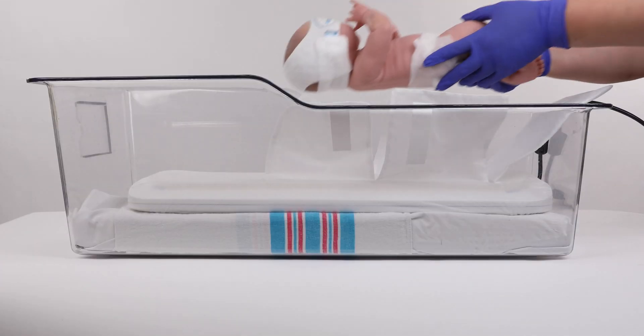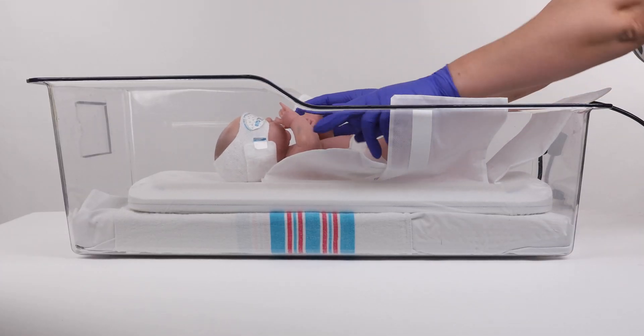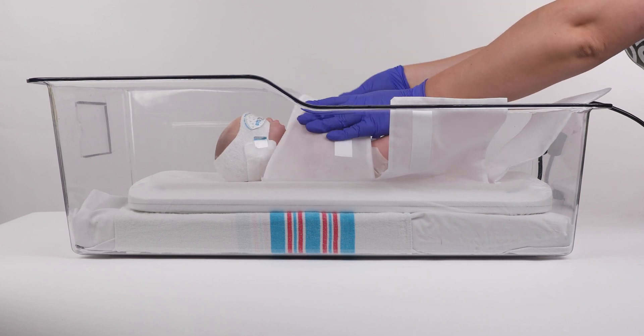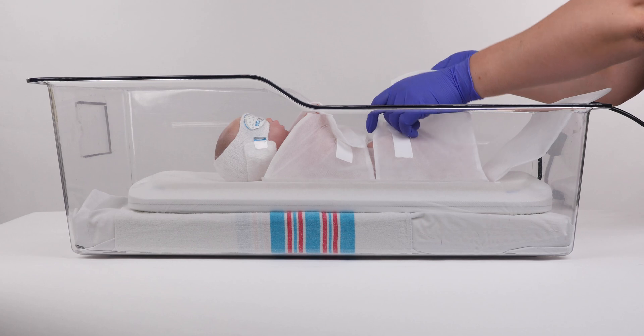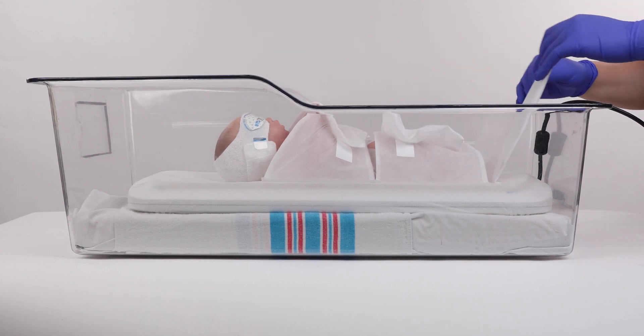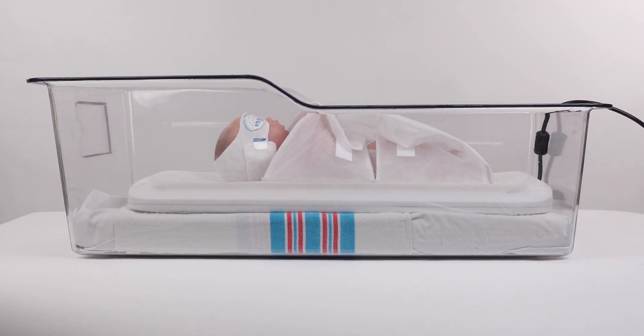Step 5: Now you are ready to place your baby on the Skylife device. Ensure that only the cloud swaddle is directly under the baby. Do not use blankets, bumpers, or anything else to cover the Skylife device.